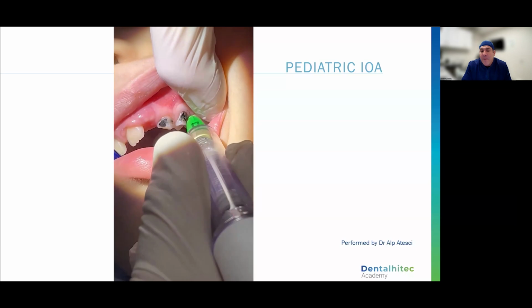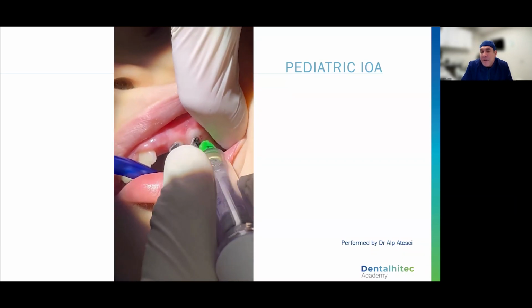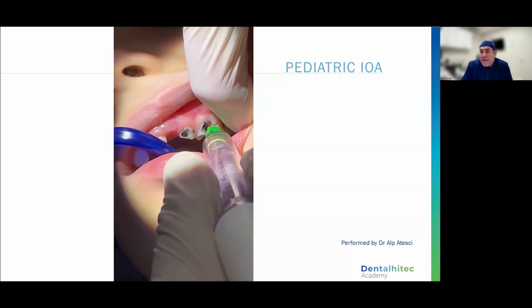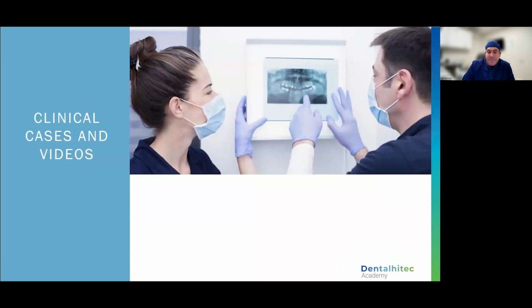I'd like to remind everybody about rotating. Sometimes the bone is thick in those areas. And if you notice here, the doctor is doing just slight rotations, Dr. Alp, and he's able to pass through the bone, but he's having to give some rotation.